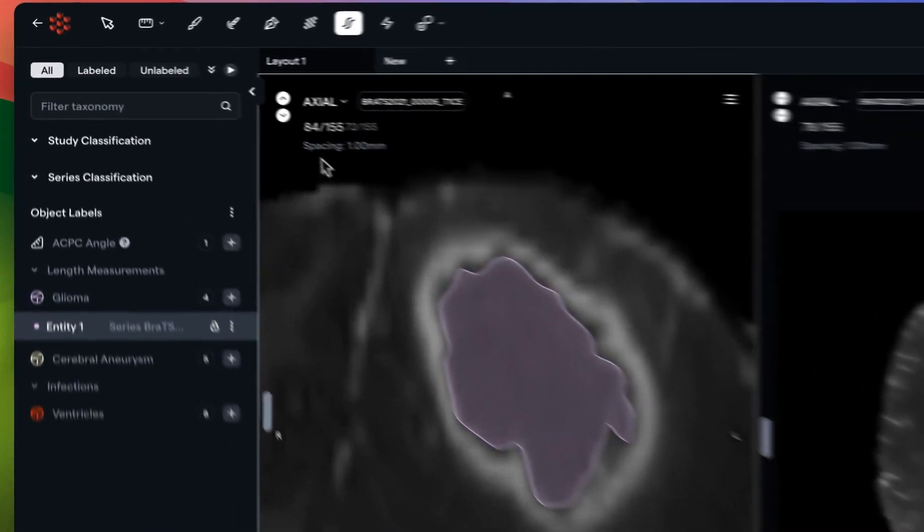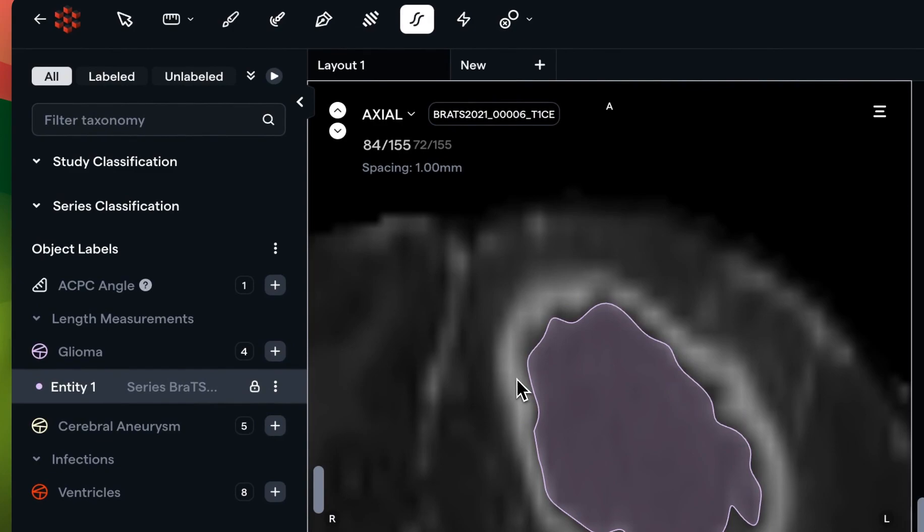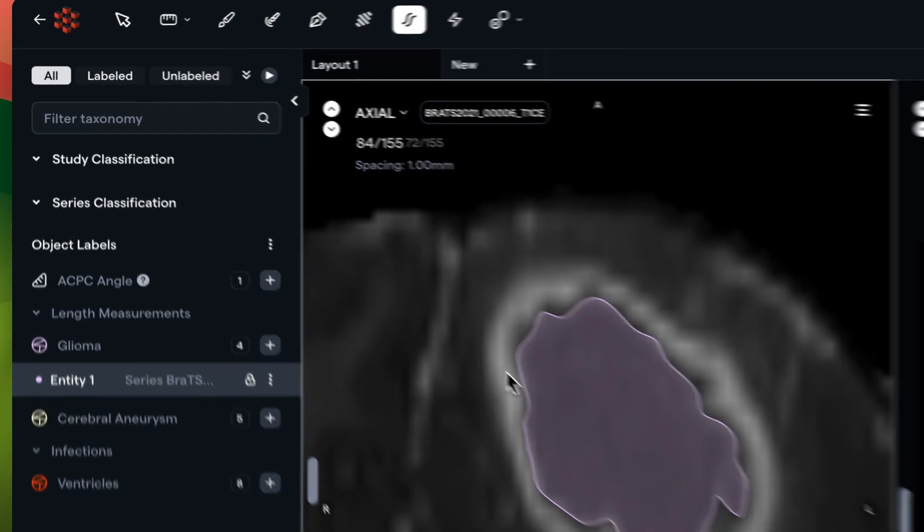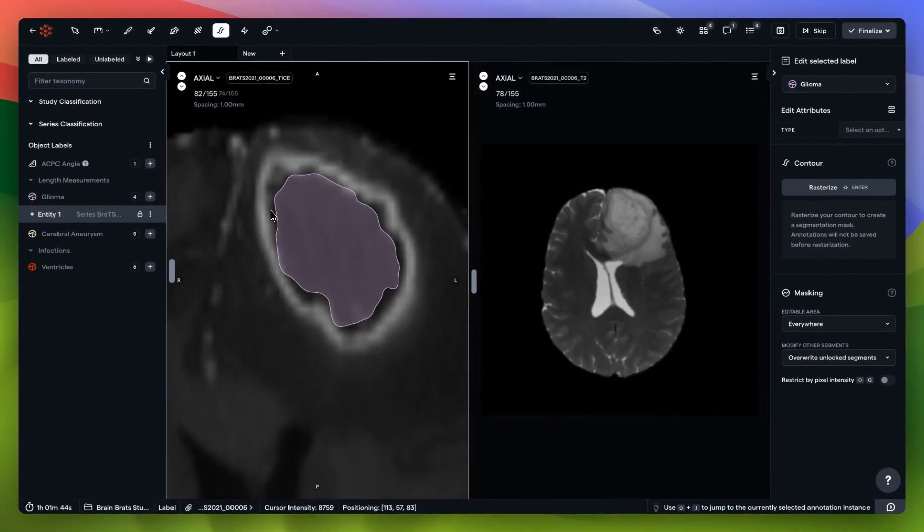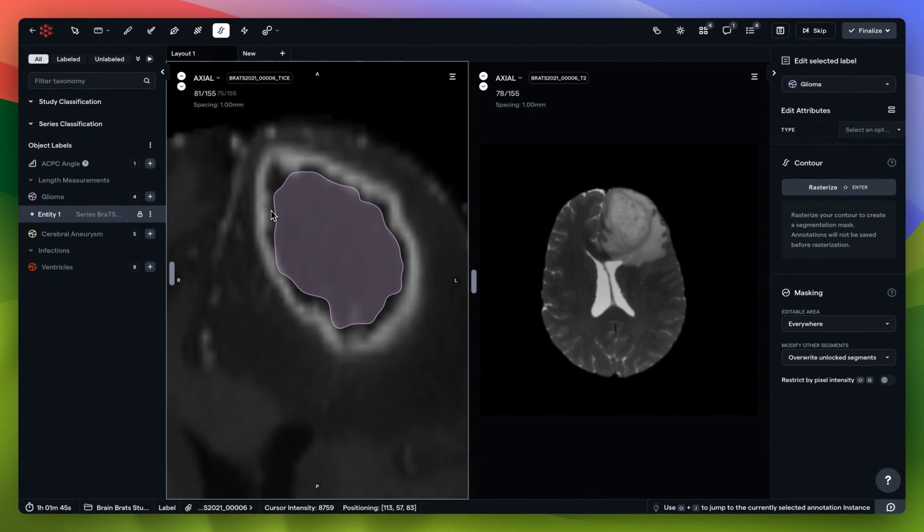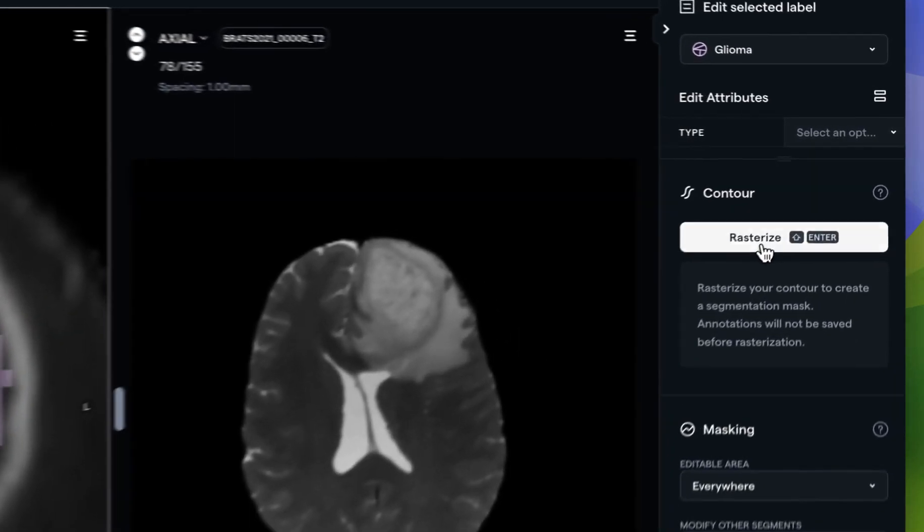The contour tool has linear pixel interpolation supported inherently, so you'll see that it's done its best to interpolate across the range. What I'll do right now is rasterize and apply the segmentation mask so that the annotation is done.